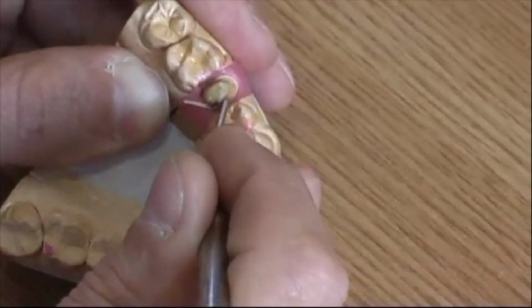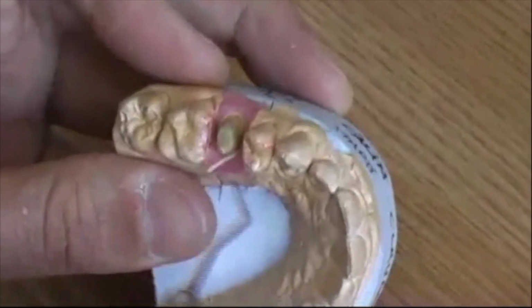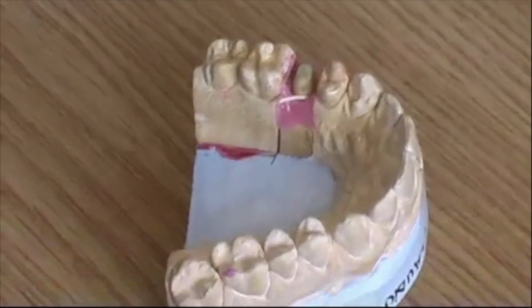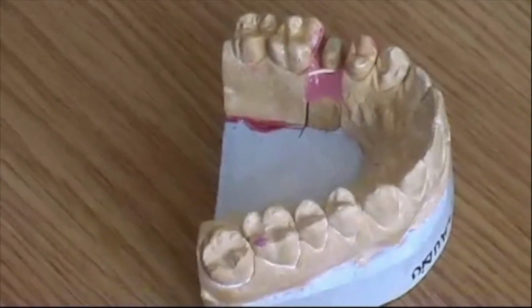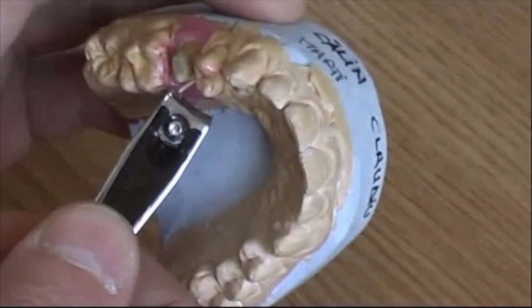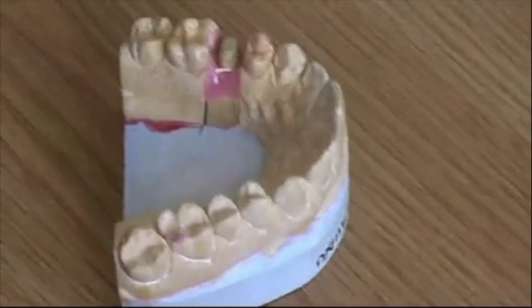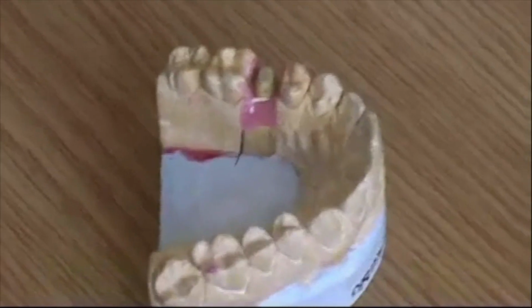But you need this retraction cord many times when the preparation has gone a little bit subgingival, because you want to keep the gingiva away from the margin of the preparation, right? In order to allow the impression material to capture everything. And now you see the cord is too long, so we have to cut it. Of course, we don't use this in the mouth, but that was just a demonstration for students, right? So we cut this, and we don't want to have overlaps. We want the retraction cord to get head to head.